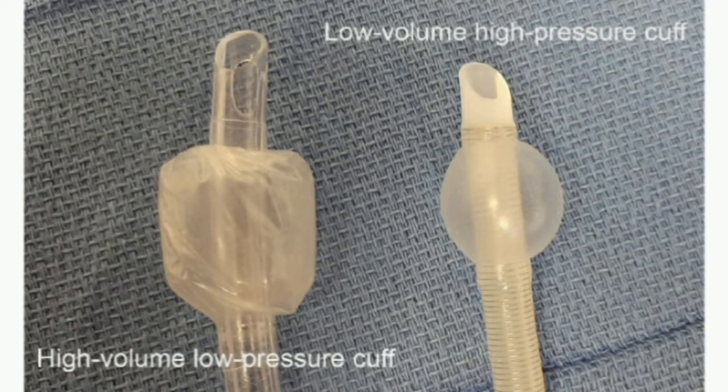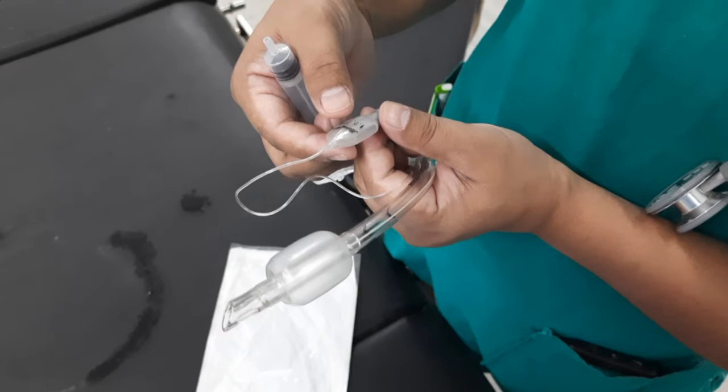In general, in anesthesia practice, ETT cuff pressure is assessed by palpation of the cuff or cessation of audible leak around the cuff. It has been shown that continuous lateral wall cuff pressure above 30 cm of water compromises blood flow, and cuff pressure above 50 cm of water completely obstructs tracheal wall blood flow. Compromised blood flow for 15 minutes resulted in superficial damage to the tracheal mucosa, and digital balloon palpation corresponds poorly with measured cuff pressures.